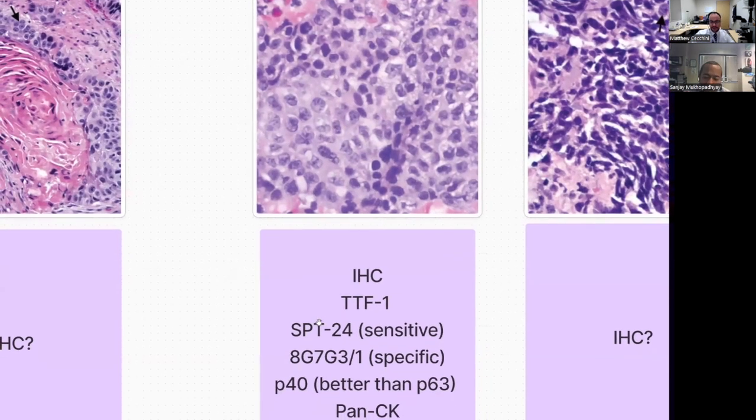So my lab actually has SPT24, which, I completely agree with you, has some pitfalls with it. You can overcall it. I think it's okay as long as you know your tool. I know that mine is oversensitive and not always specific, so I can't rule out that it's just staining something else. So I always use it in context of other stains, and I'm cognizant of that. In some ways, the ideal thing is actually having both, because they can help you ask different questions.